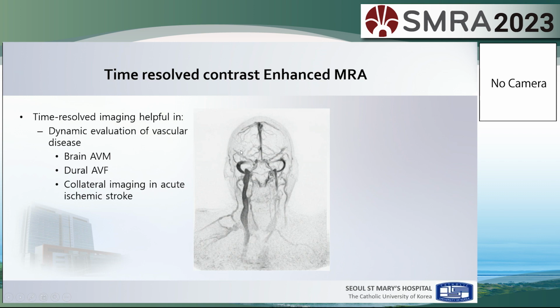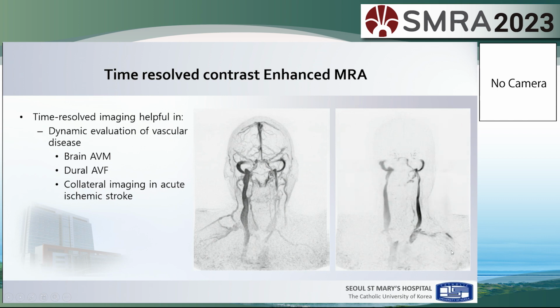But for the technical aspect of acquiring the contrast enhancement, you should not inject contrast media on the left side, because in some patients the contrast media does not go directly to the heart, but refluxes into the left internal jugular vein and then to the right side to get to the cardiac.